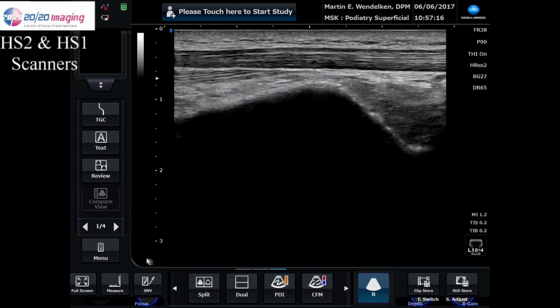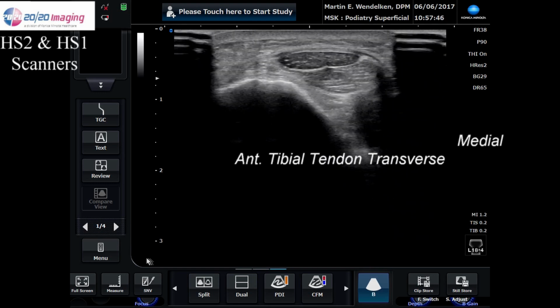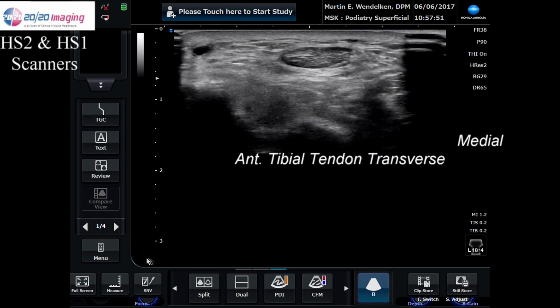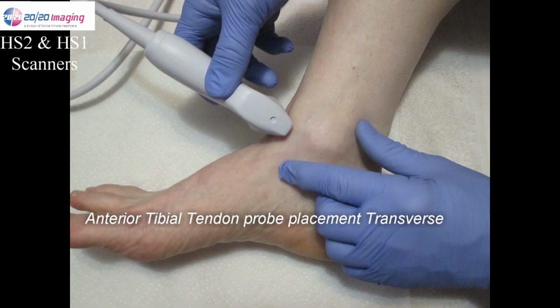Let's now change the probe to the transverse axis. Again, here I'm running the probe proximal to distal, transversely, and now I'll show you the probe position. Here I am right over the anterior ankle.